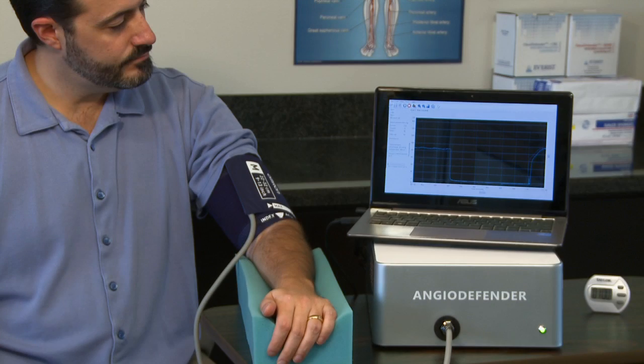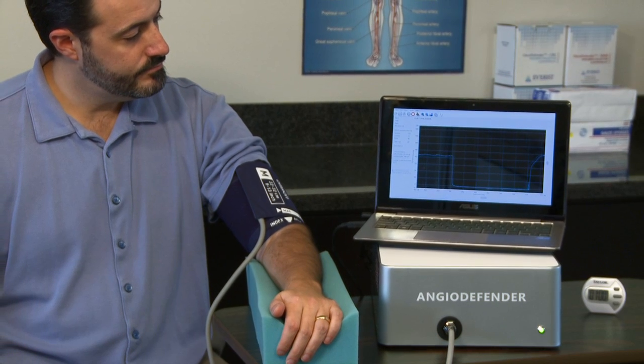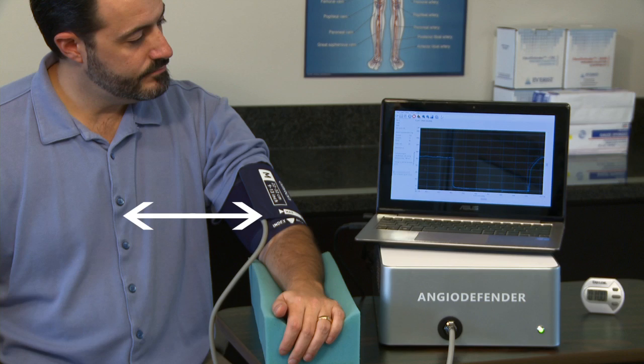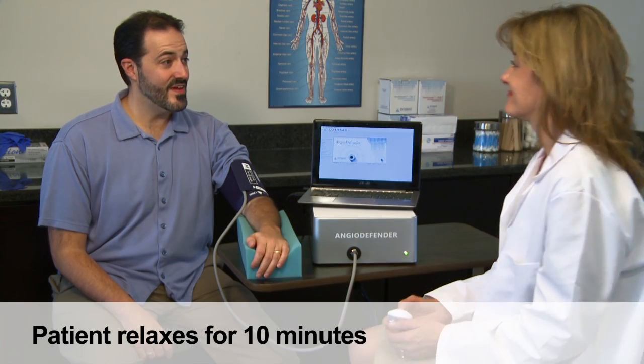The patient should be seated with the cuffed arm nearest the device. The patient's arm should be relaxed and fully supported. The cuffed arm should be at the same level as the heart. The patient then rests for at least 10 minutes prior to the commencement of testing.